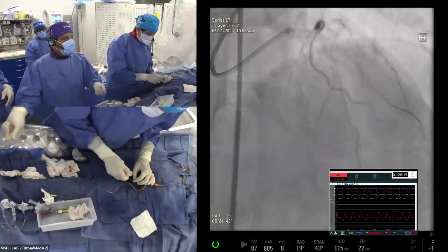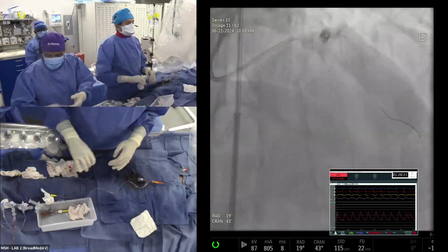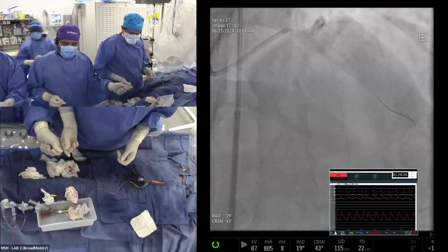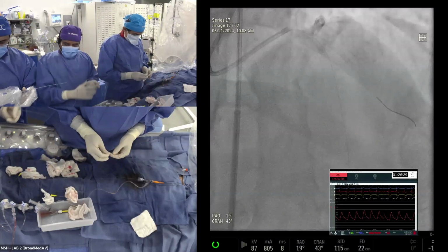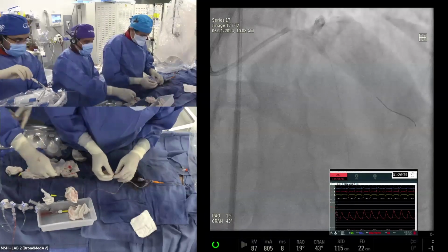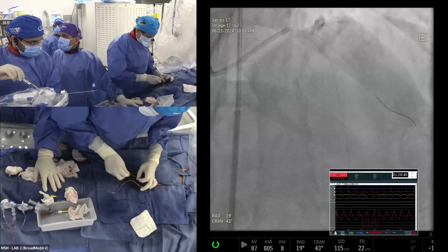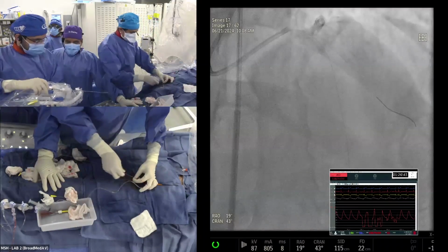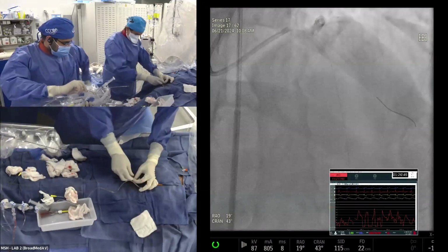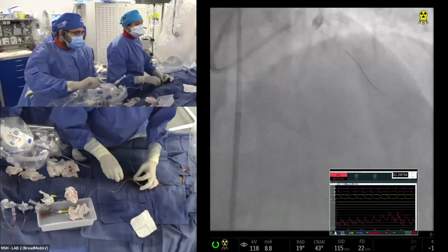So the question comes in here, it looks very good. I think we do the IVUS just to see that the cutting balloon has made some cuts. We definitely found in our RotaCut trial that the calcium fracture was higher in the cutting balloon group, although this is very mechanistic, compared to the high pressure balloon. Rota plus cut has a significantly higher calcium fracture in the RotaCut trial. Do you mean a high pressure non-compliant balloon going to 20 atmospheres?